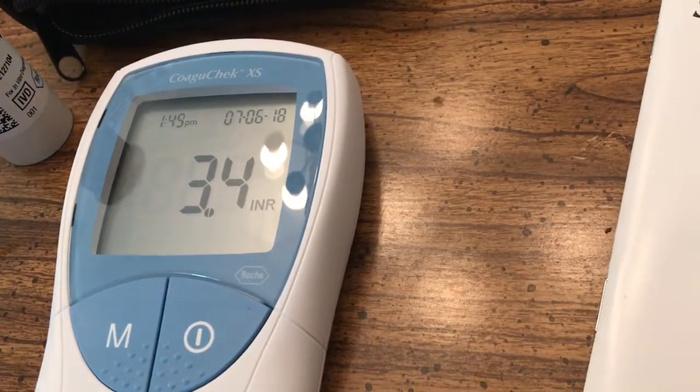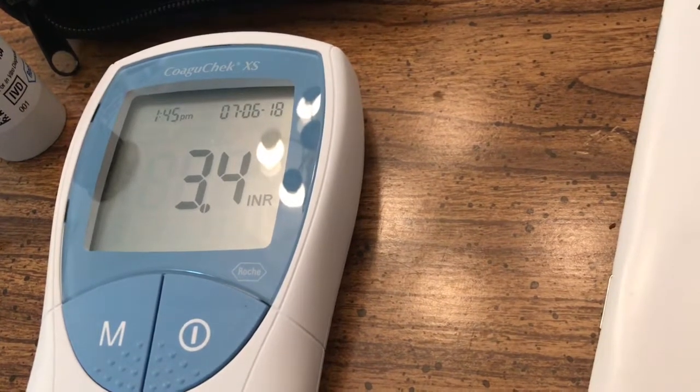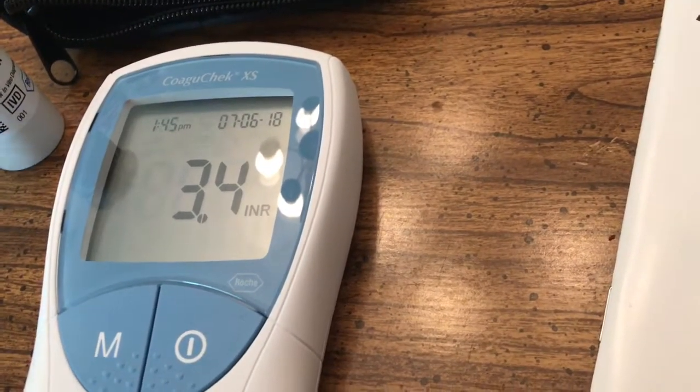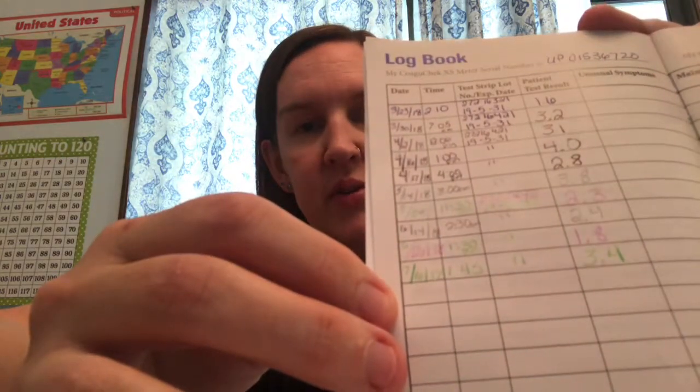The system beeped and it gave me an INR of 3.4, which is actually a little bit high for me today because I'm supposed to be between 2 and 3, so they may have to adjust my medication a little bit. Much easier than going to the lab and being pricked and giving blood. So we go ahead and log our results — today is July the 6th at about 1:45 in the afternoon, and my blood level is at 3.4. This machine will monitor that but it will not electronically send my results to Allere, so I have to phone in or use the app on my phone to send them my results, and then they will contact the doctor who will call me back to let me know how I need to adjust my blood thinner pills.